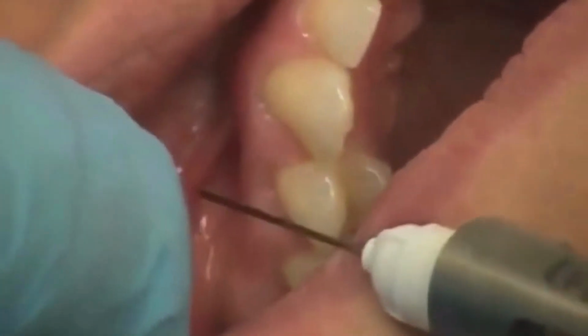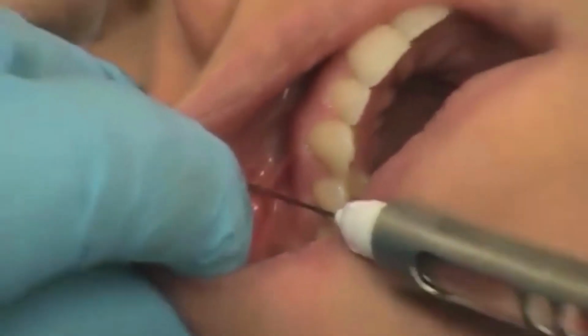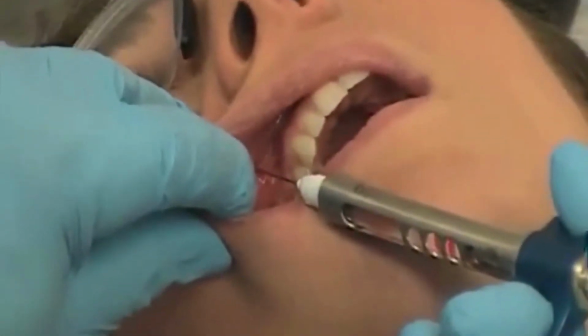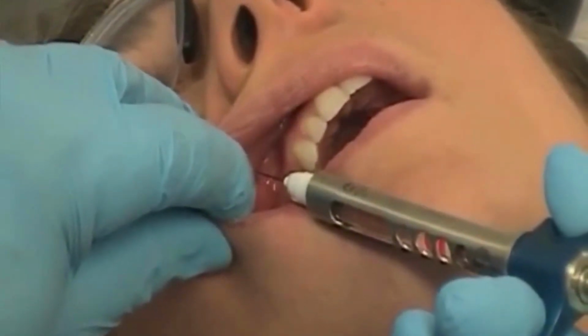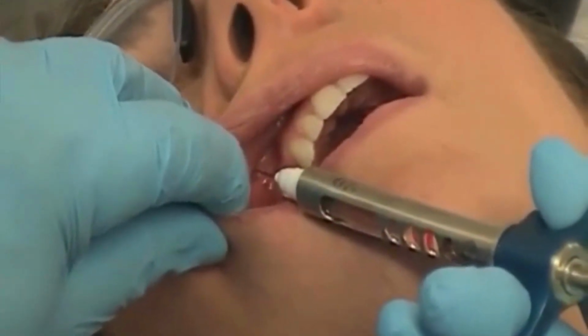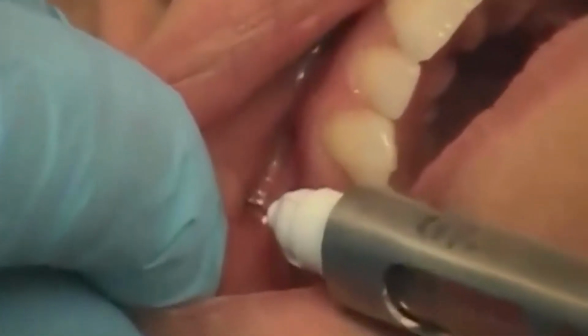The needle should be directed superiorly and remain parallel to the second bicuspid until it is palpated near the foramen. Before injecting the anesthetic, it's important to aspirate to ensure the needle is not within a vessel. It's important to avoid injecting the anesthetic into the foramen by keeping firm pressure on the inferior orbital rim with the palpating finger.